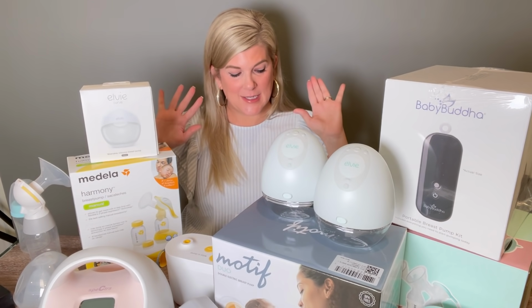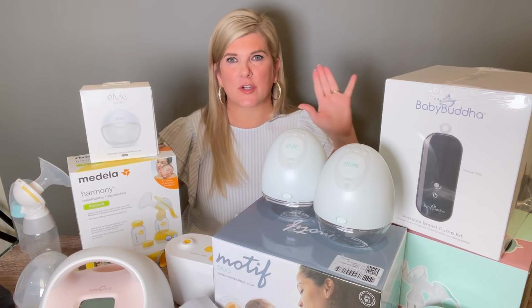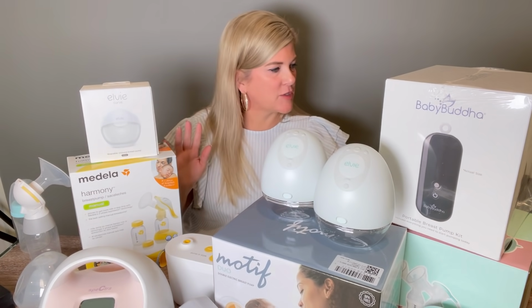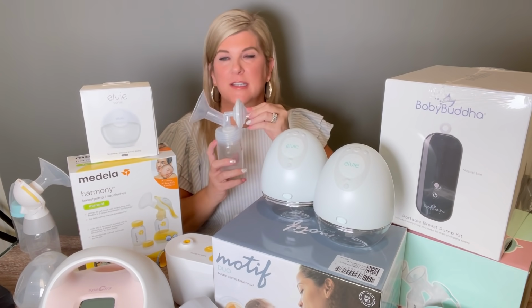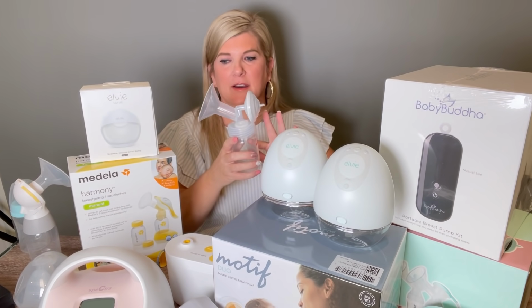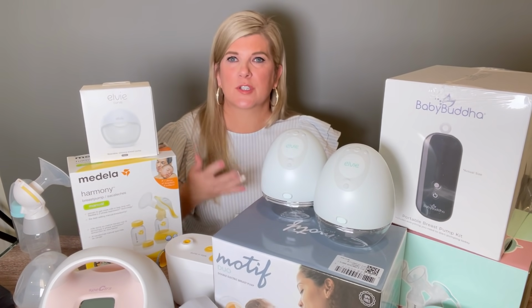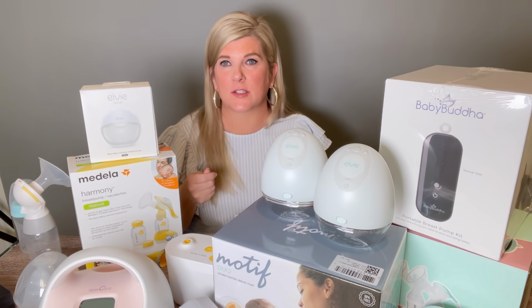And then also just some key differences of the breast pumps. And this kind of term, in my opinion, is going away a little bit, but you get your open system versus your closed system. And again, I was talking about this little backflow protector. This prevents milk and moisture from getting back into the tubing because it just physically can't get there. Some of the older systems didn't have this backflow valve, and it would basically mean that you needed to clean the pump parts more, like the tubing and so on and so forth.